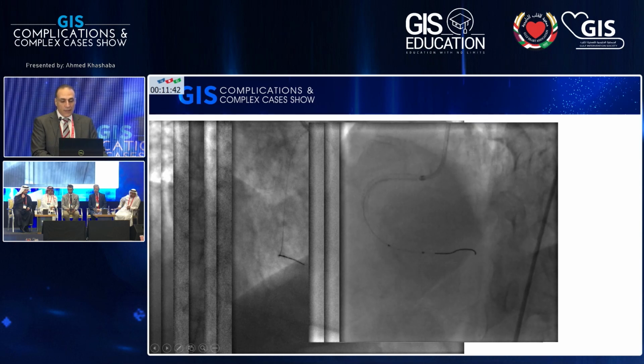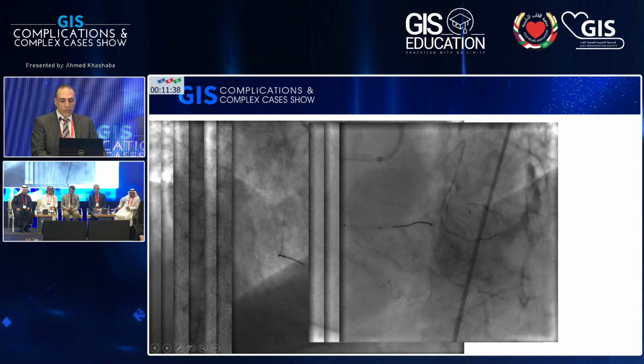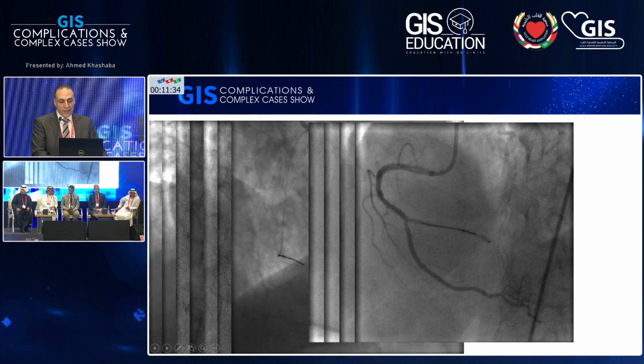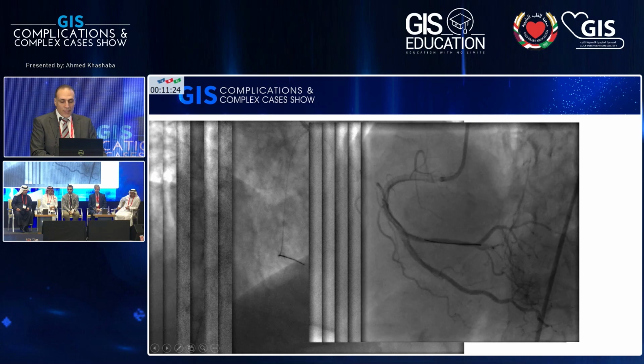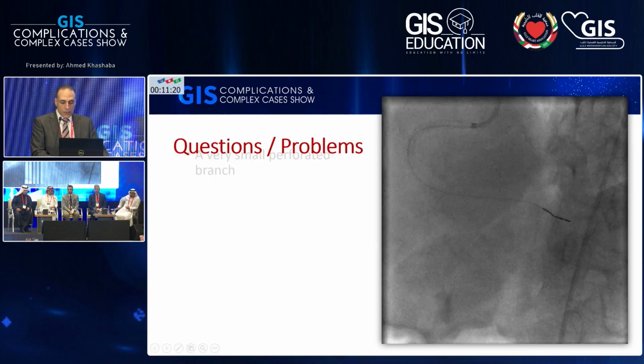And then after the 30 minutes, still the perforation is there and it increases even. So you can see the flow is increasing. Again, I tried a more proximal prolonged balloon inflation for another 30 minutes, but the situation is the same, and this is how the balloon looks while inflated, no other perforation, but still.